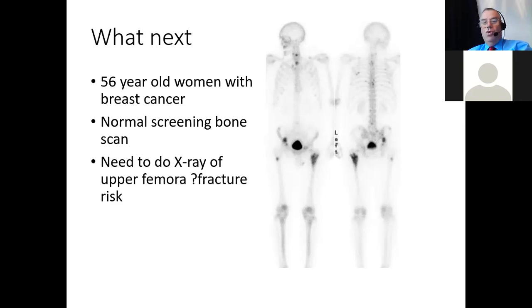So both of those probably earn a check X-ray if it's not been done recently, or check CT to make sure that there's no fracture risk. If you've got a SPECT CT, of course, you can do that all yourself. And certainly if you were running a one-stop shop, that's maybe what you would like to do, a SPECT CT at that site to determine if there's a fracture risk. So all these options are available to us. But this patient, somewhere in the report, you'd have to note the need for further investigation.